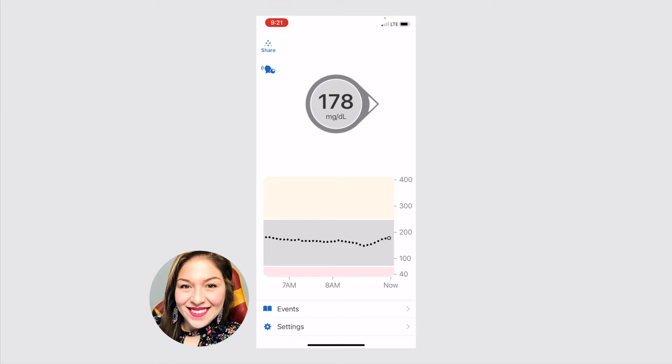That way you can either adjust for a high if you need to take insulin or adjust for a low if you need to get some juice or a snack. Underneath the number, you'll see a graph.